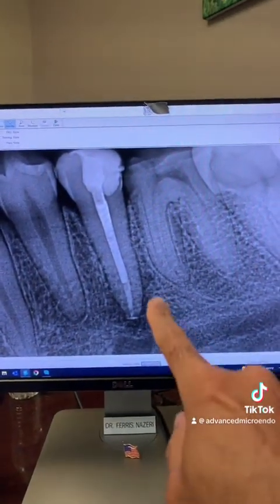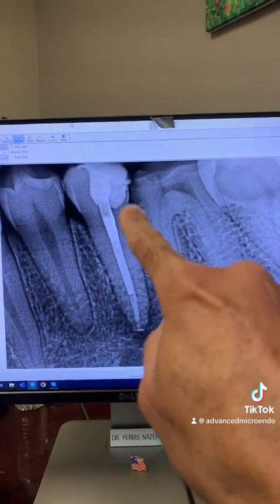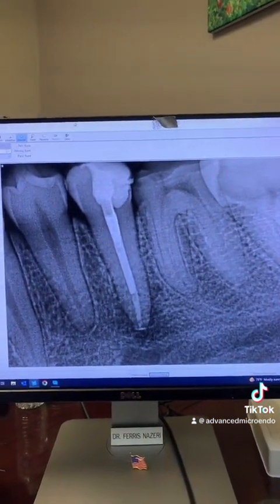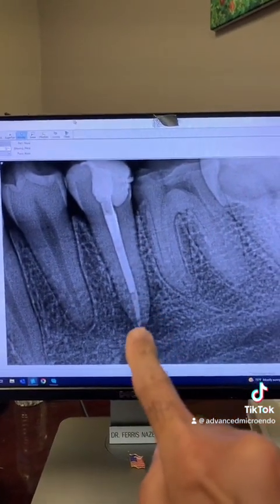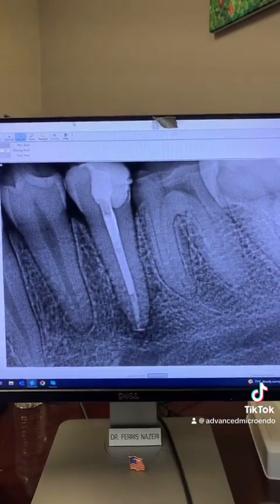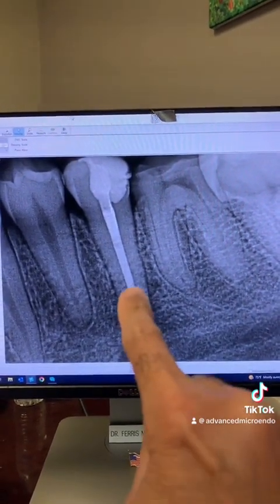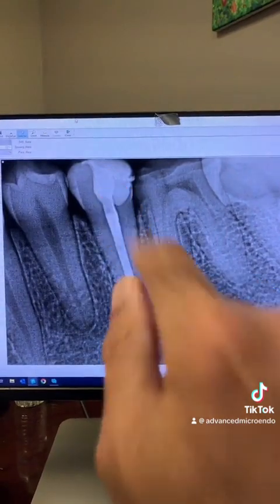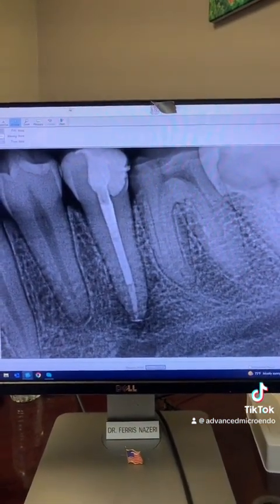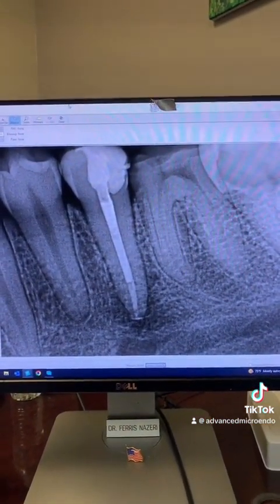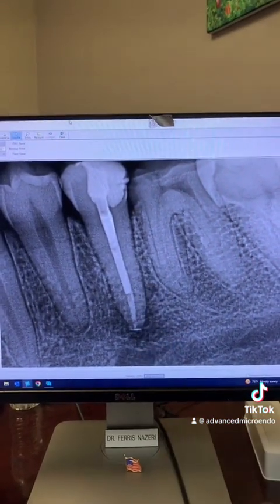Here's the post-op. We removed the decay, rebuilt the missing walls, and as you can see, there is one canal system. The apical diameter was over 50, so I placed an MTA plug followed by gutta-percha and sealer, temporized the tooth, and referred the patient back to his dentist for the permanent restoration.